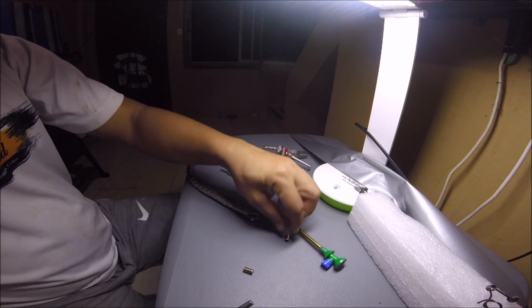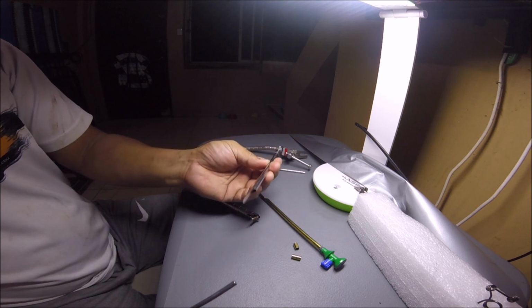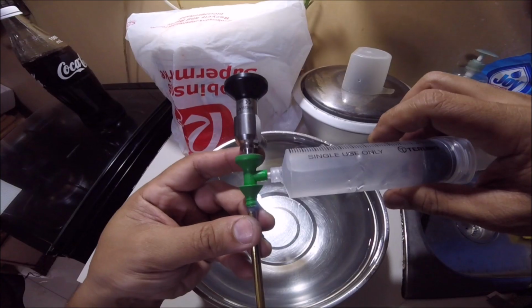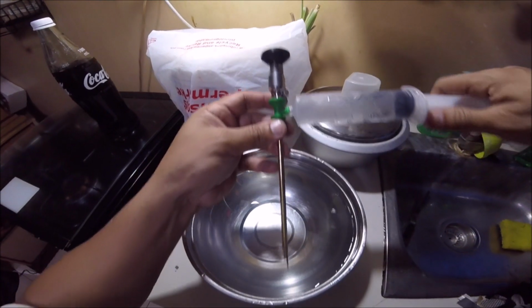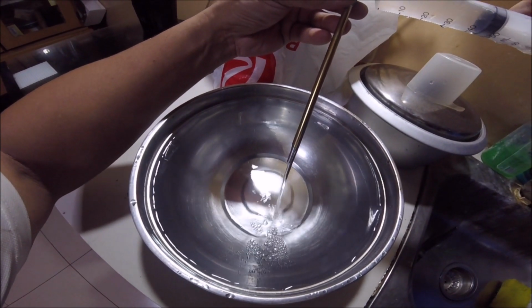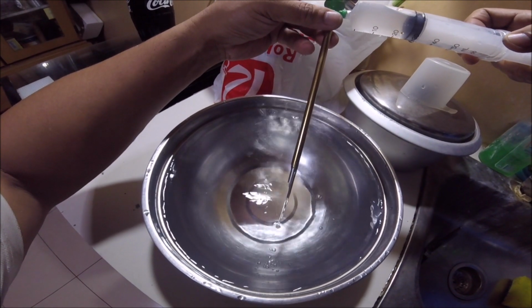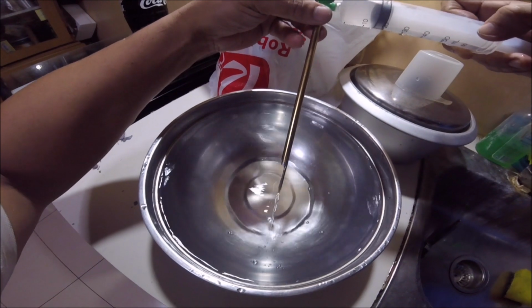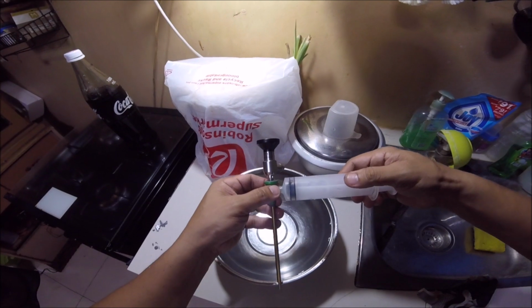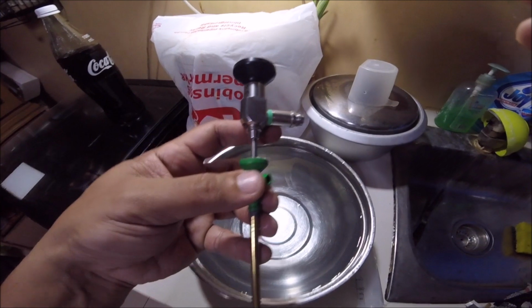So this is the new version with the spacers. This is the older version, the simple one. I can still use either. It definitely works.